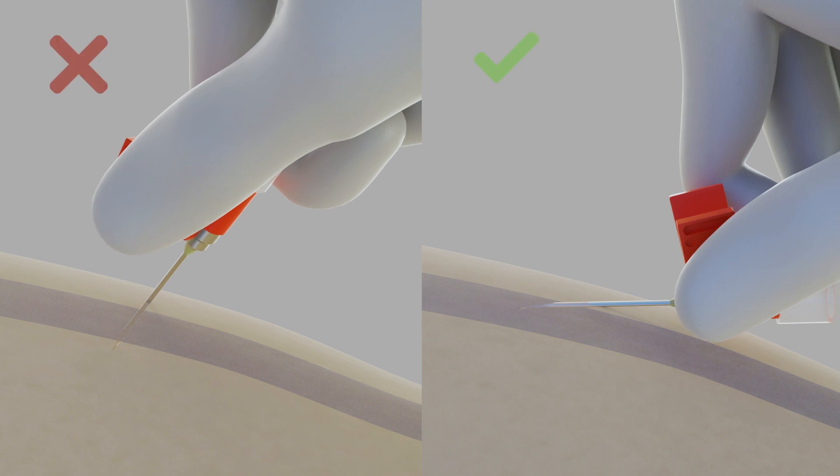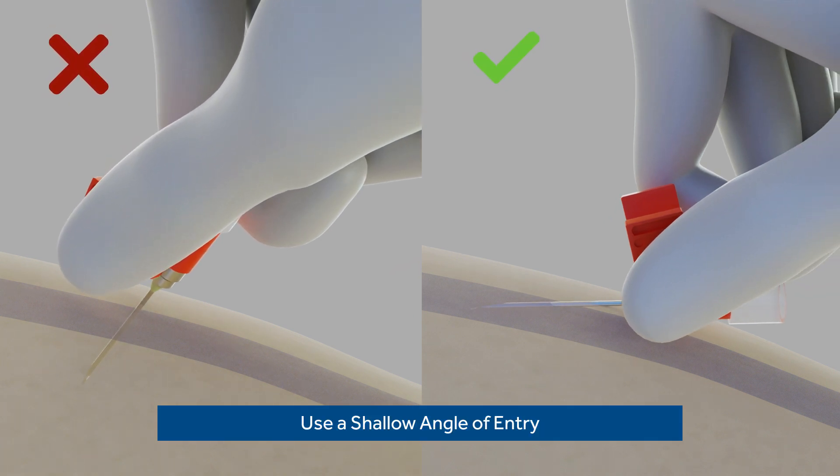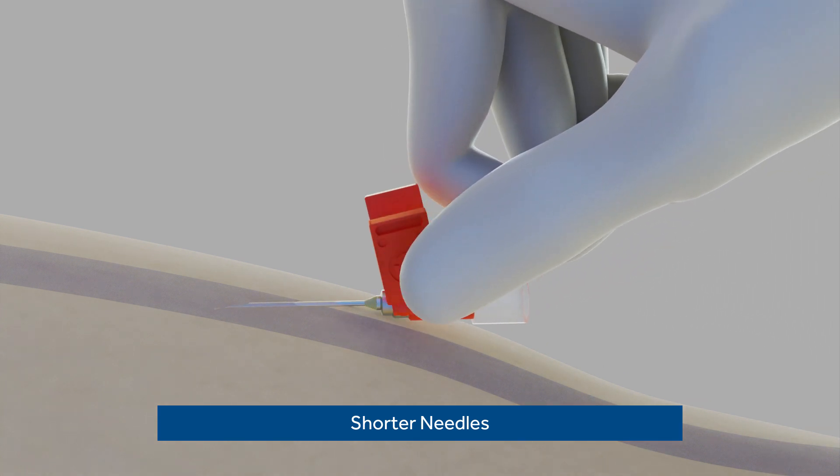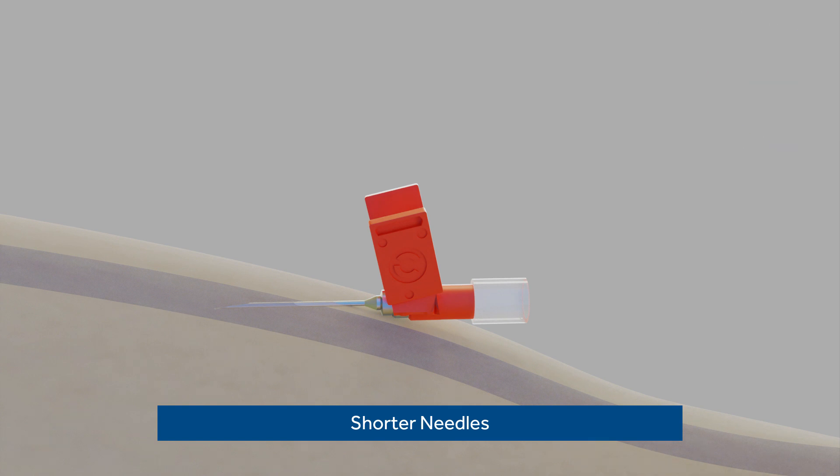For cannulation, note that you should use a shallow angle of entry, as percutaneous fistulas are not deeper than the normal surgical fistula, though individual anatomy can vary. Some new AV fistulas may benefit from shorter cannulation needles. Ask your patient's nephrologist if this would be beneficial.